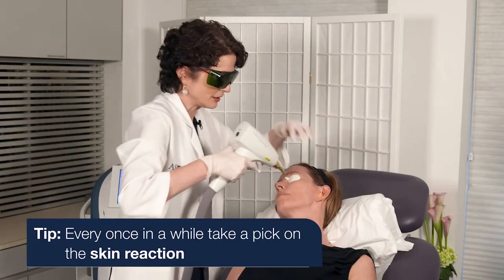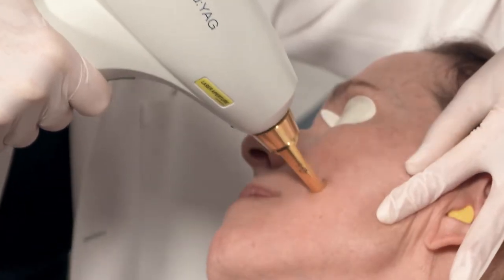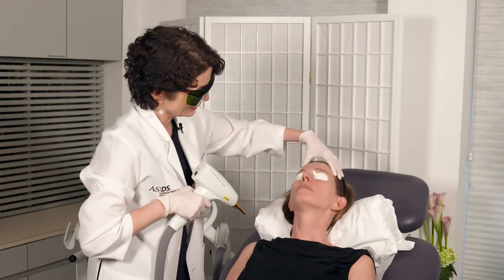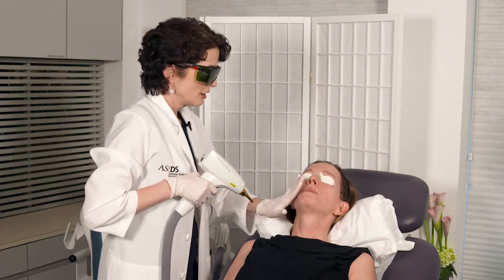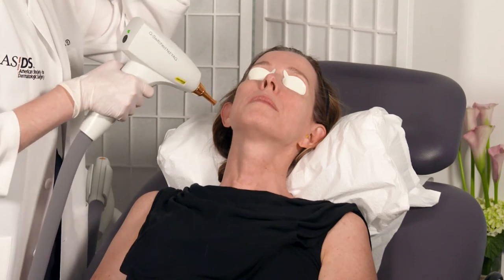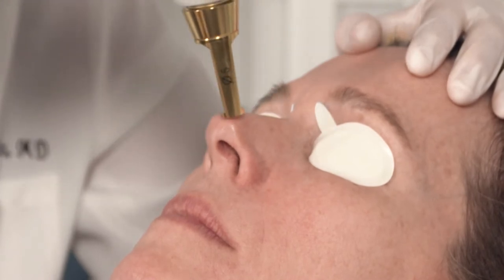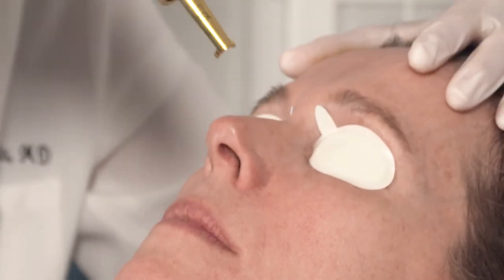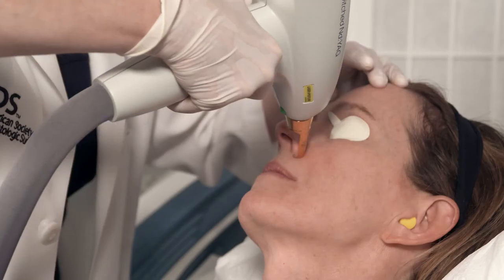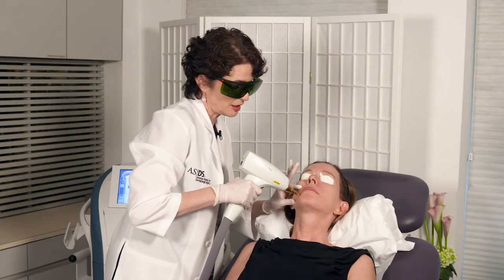Every once in a while I just take a peek at how the tissue-laser interaction is going — it's as expected. There's just a little bit of background erythema building up but nothing too major. I'm going to complete the treatment by doing the nose and perioral area, then the chin and lastly the upper lip.